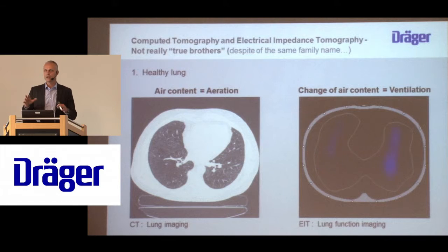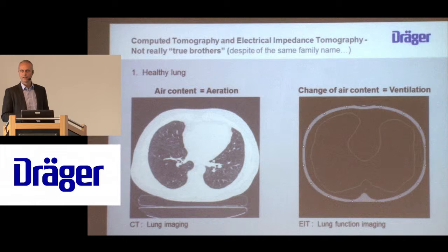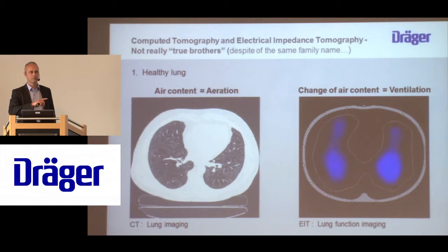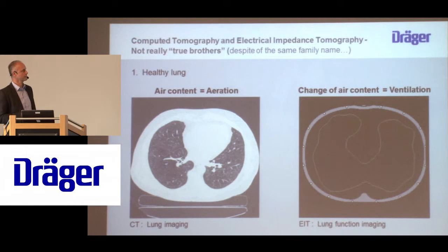So no matter what the real impedance is, because it's called impedance tomography, we are just setting all the pixel values at the end of expiration to 0. And so we look at what happens during the inspiratory phase when the impedance starts to increase. Fortunately, there's a pretty linear relationship between the increases of volume and the increases of impedance, at least in one single patient.